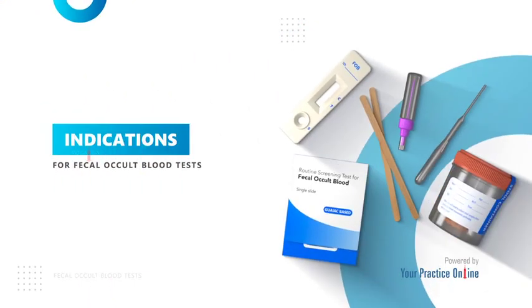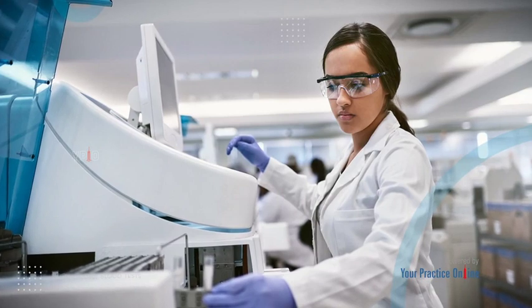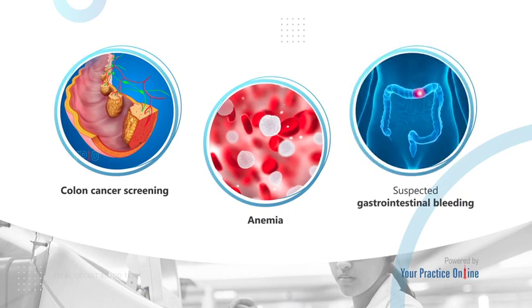Indications for fecal occult blood tests. Fecal occult blood testing is generally indicated for colon cancer screening, anemia, suspected gastrointestinal bleeding.